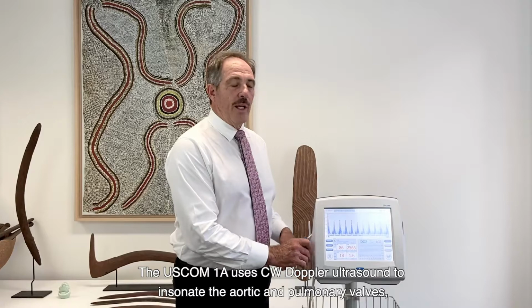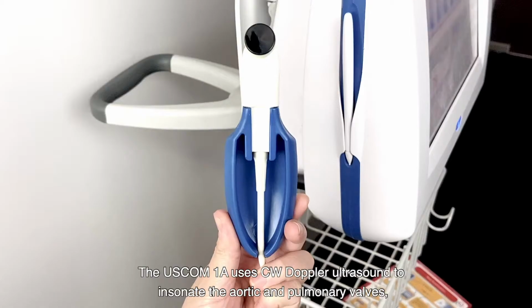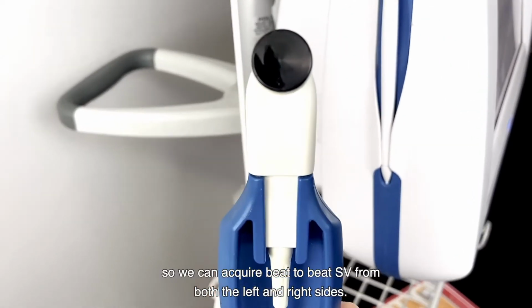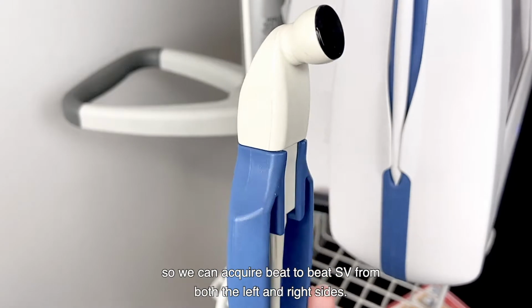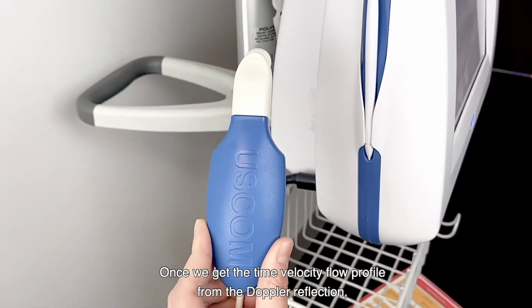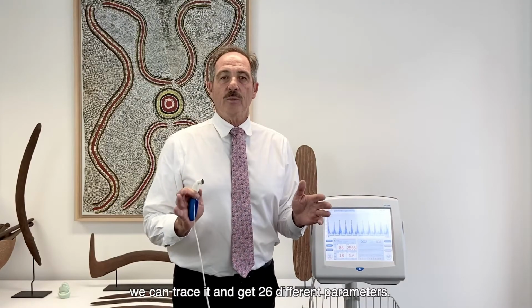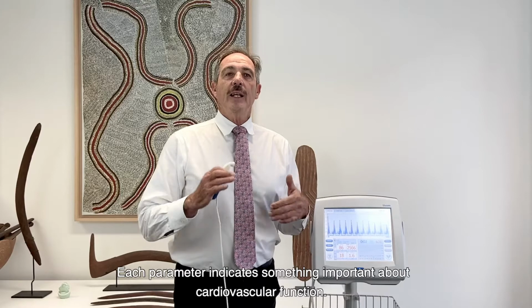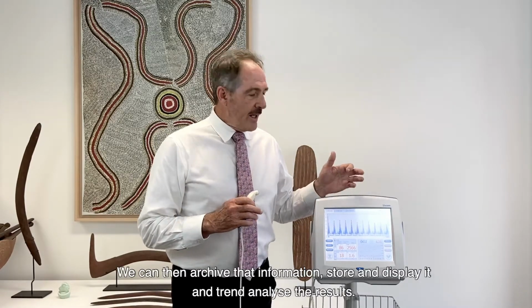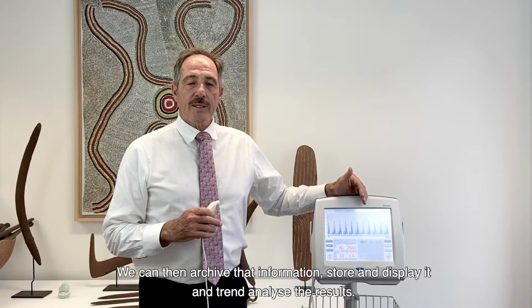The Uscom 1A uses continuous wave Doppler ultrasound to insonate the aortic valve and the pulmonary valve so that we get beat-to-beat stroke volume from both the left and the right sides. Once we get the time velocity flow profile from the Doppler reflection, we can trace that and get 26 different parameters. Each indicates something important about the cardiovascular function. We can archive that information, store it and display it in a trend analysis.